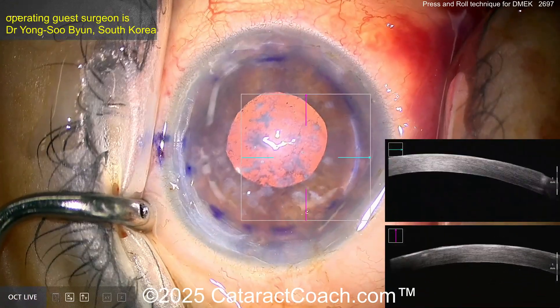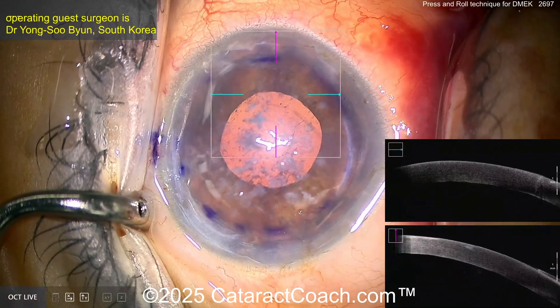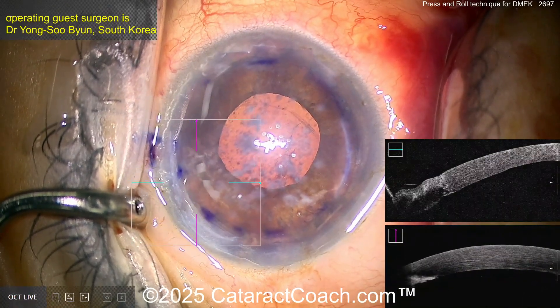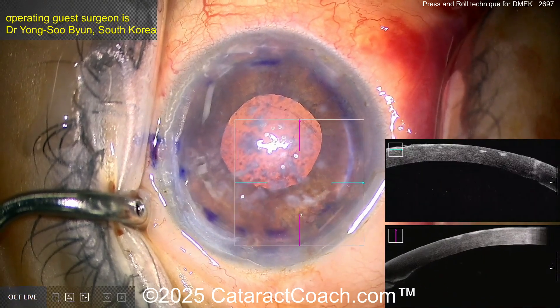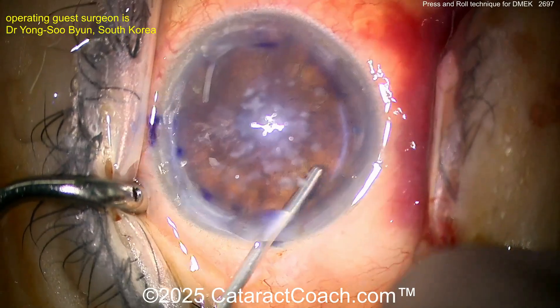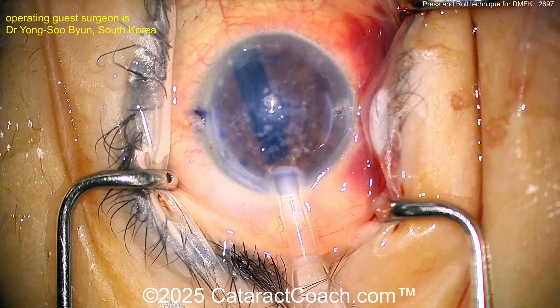The Descemet's layer is being taken off, and OCT confirms in all quadrants that there is complete removal. Once stripped, the graft is placed inside the eye. An air bubble technique will be used — something the presenter hasn't seen before. A comment is requested from DMEK experts like Jack Parker.